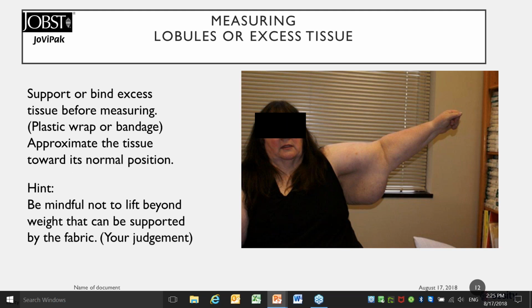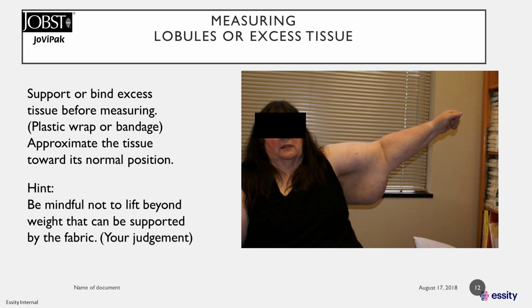All right, now let's talk about measuring lobules or excess tissue. Make sure that you are going to bind that excess tissue before you measure it. We can use plastic wrap or a light layer of bandage. Approximate the tissue toward its normal position, and it needs to just gently be lifted.